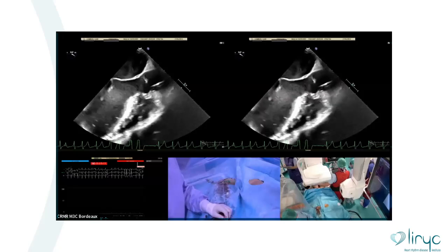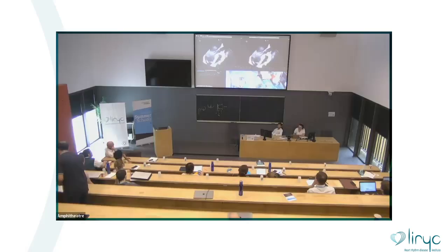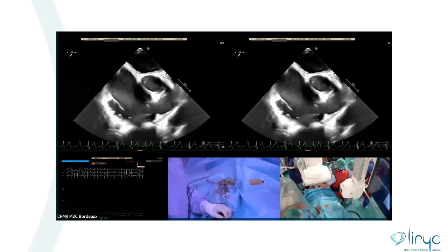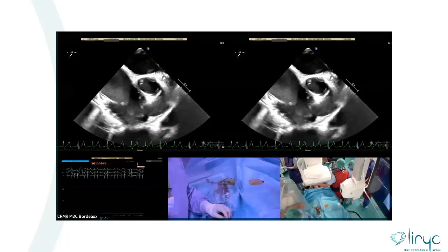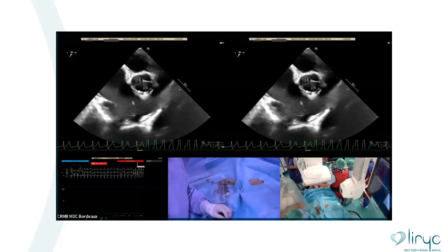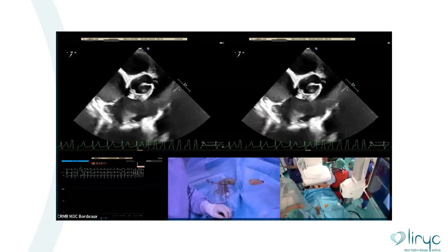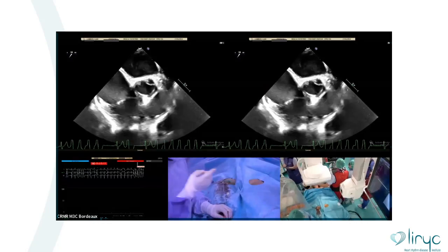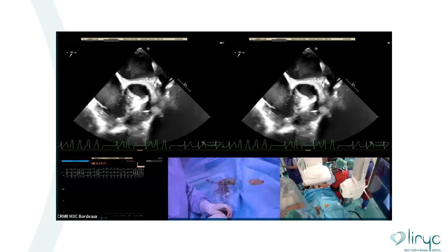Yeah. I think we are possibly in the right ventricle, meaning that we pass through the shunt. Okay, I see the wire. In the RVOT, we also have PVCs showing that we probably are in the right ventricle. You can find the wire. Okay, so maybe we can advance.